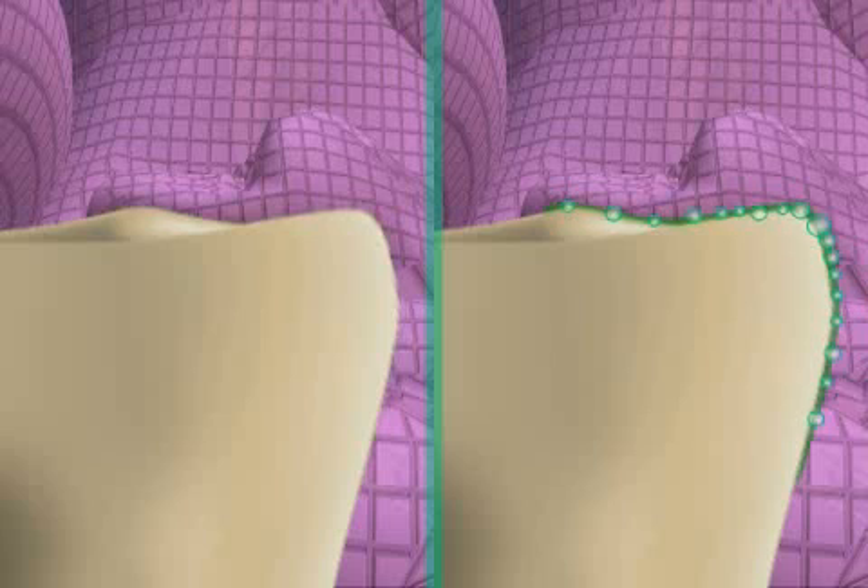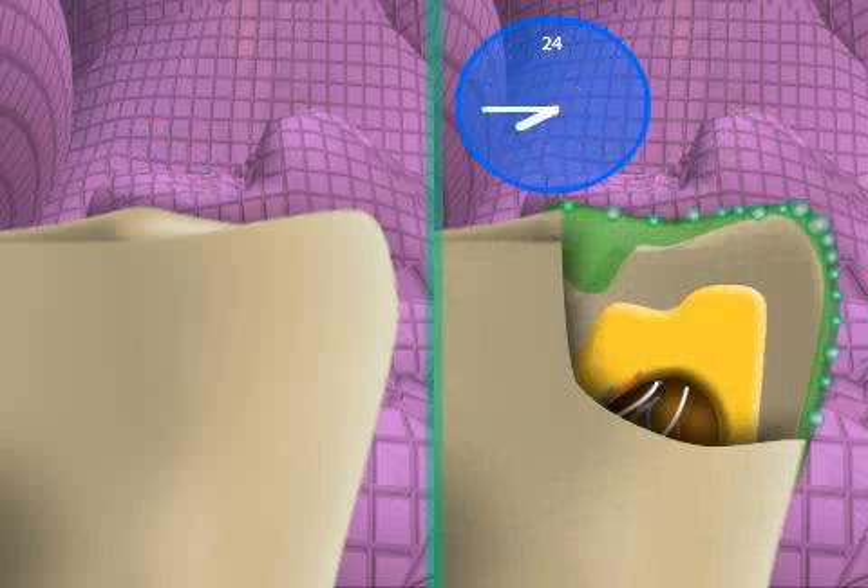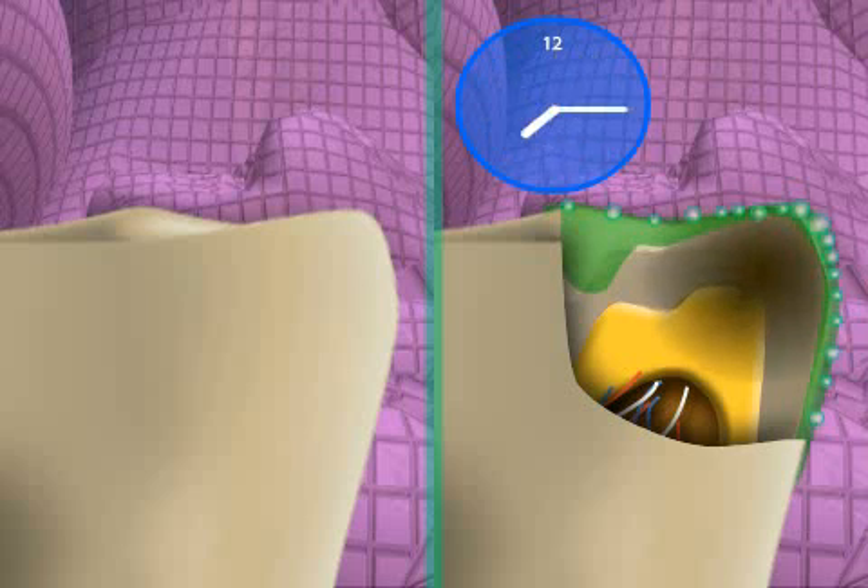Such small differences can cause ceramic inlays to appear brand new and without any visible glue gaps, even after a number of years. In the other case, you can see the glue gap after only a few months. This also increases the risk of cavities because the connection between tooth and inlay is not optimal without Air Block.